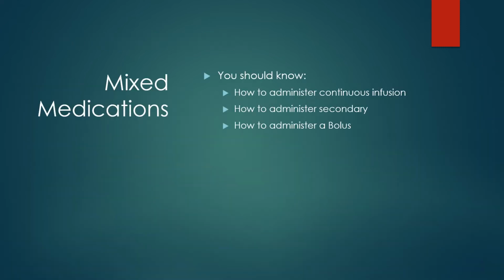So let's move into administering some medications through our IV. We've started the IV, we have it saline locked, now we need to administer medications through it. This can happen in a couple of different ways. First, we can administer it through a continuous infusion. This is where you have a large volume, one of those really big 1,000 ml bags. You attach it to your IV and it's running all the time, both day and night.